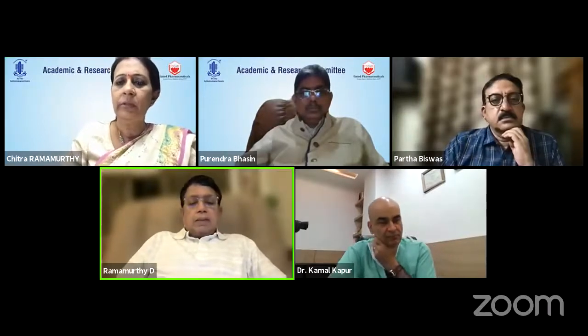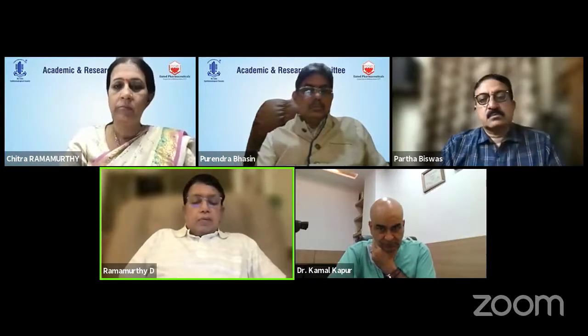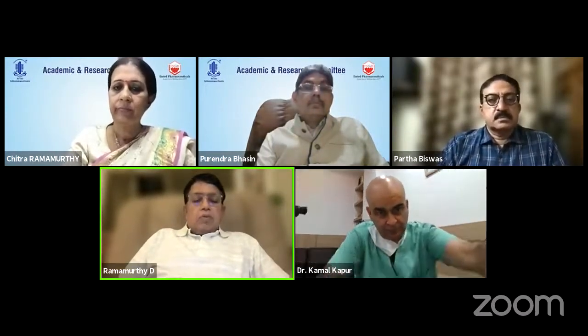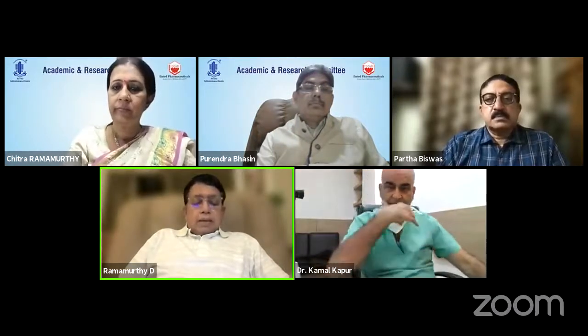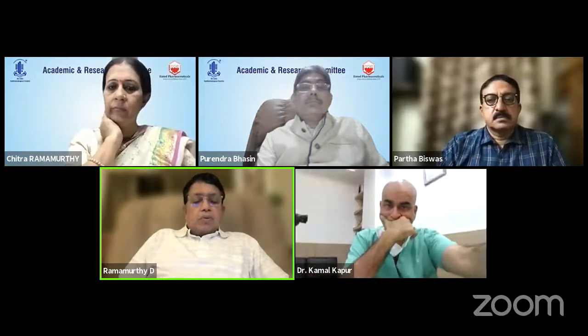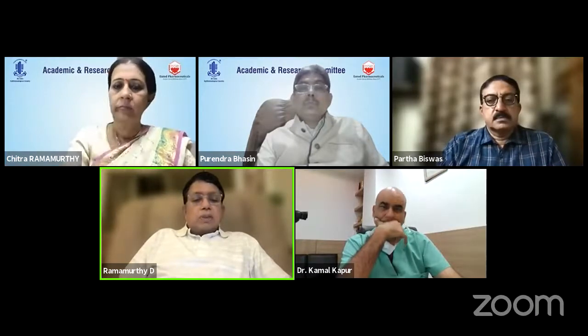Yeah, I'm there. No, 2.8 is what I go by, even for hyperopic eyes. If it's 2.8 millimeters or more, we go with that. We don't go less than that. And most of these lenses, whether it's Indian or imported, comes with a central flow now, with a central opening. In these cases, I think doing a PI doesn't really add much value.